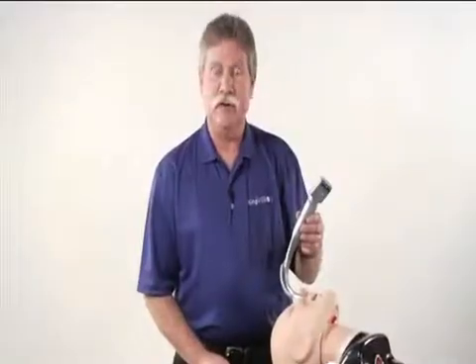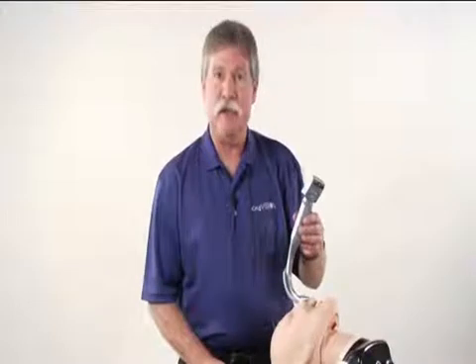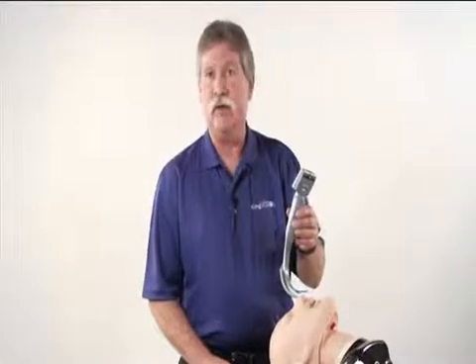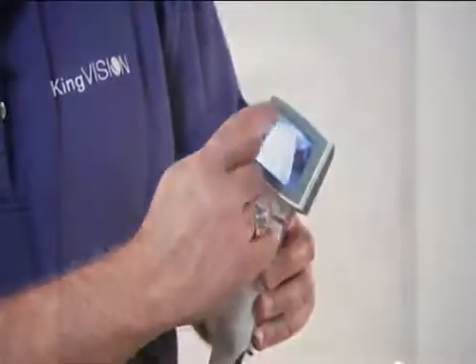The blade curvature was designed to arrive at an appropriate compromise between being able to visualize the vocal cords by looking around the corner to allow visualization of an anterior larynx. What this means is that you will not be able to use this blade to directly view the vocal cords. But you should not have to manipulate that much to be able to visualize the cords, even in anterior larynx. Another thing to point out is that the underside of the blade is actually visible on the screen, and this is an intentional design so that there's no blind spot and that there's a landmark as to where you're placing the tip of the blade.